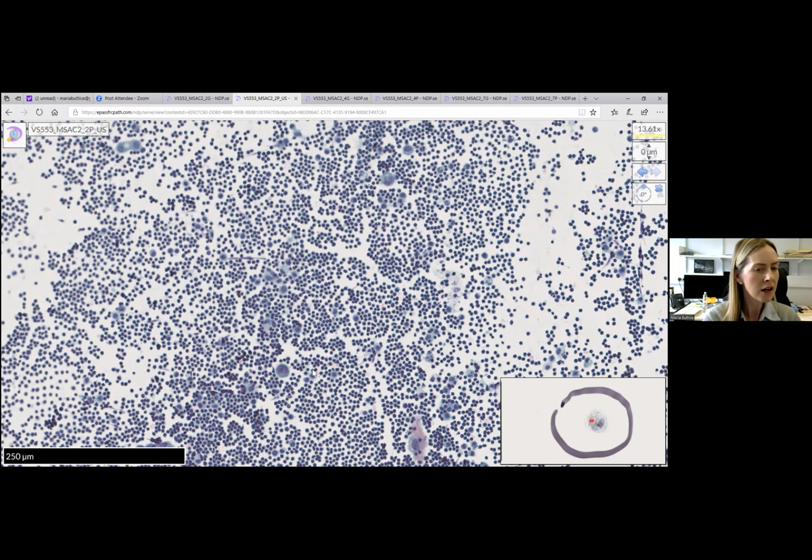In the case of a lung adenocarcinoma, the oncologist wants to know the ALK, the ROS, the PD-L1, EGFR, and the RET mutation status before they're commenced on treatment. So important to confirm using a limited immunohistochemistry panel. So for this, you could do a TTF1 or a GATA3, and then you've got material to do ER, PR, and HER2 given the clinical history. And obviously linking your answer to the clinical history. So given that she's got a breast carcinoma, this would probably be the first site of origin to exclude, and discussion at the MDM. So yeah, fantastic, well done.